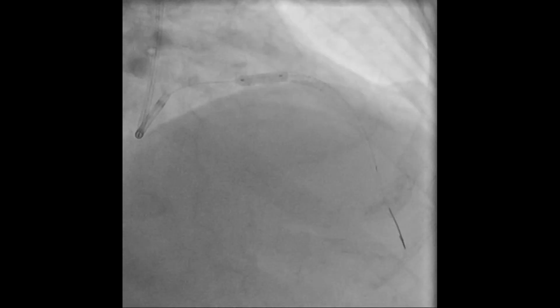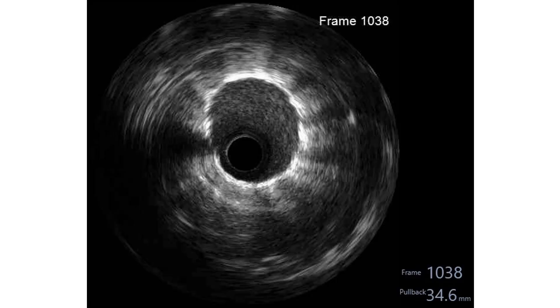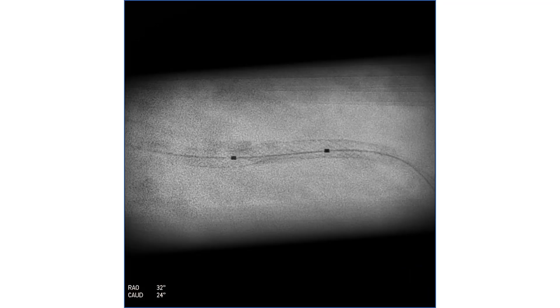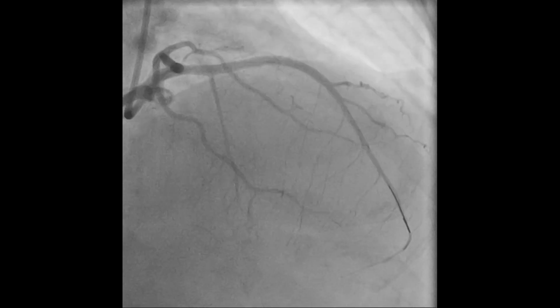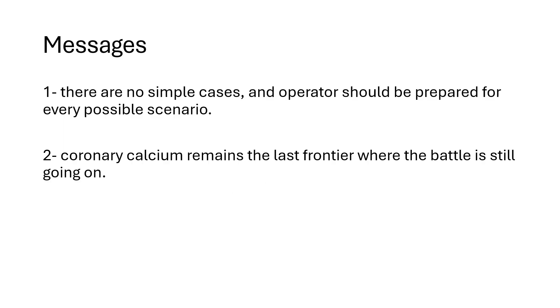Post-dilatation was done by NC balloon 3.5 at the proximal part. IVUS showed good stent expansion, and this shows how a stent graft looks on IVUS with significant reverberation. This is the stent boost after the stent graft with better expansion, and this is the final angiographic result. The message from this case is that there are no simple cases and operators should be prepared for every possible scenario. Coronary calcium remains the last frontier where the battle is still going on.